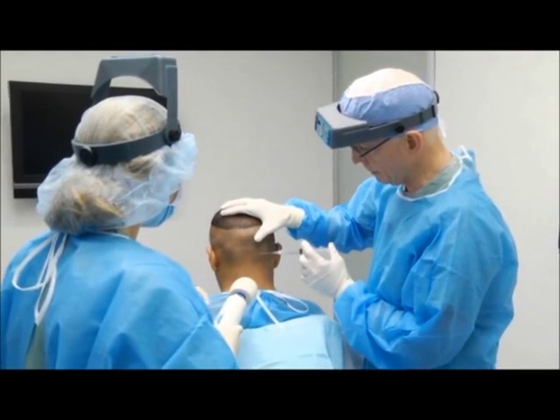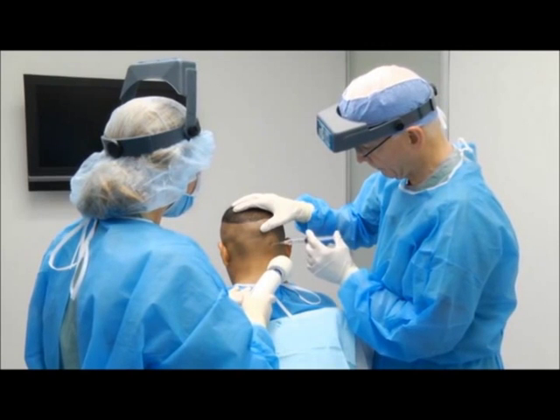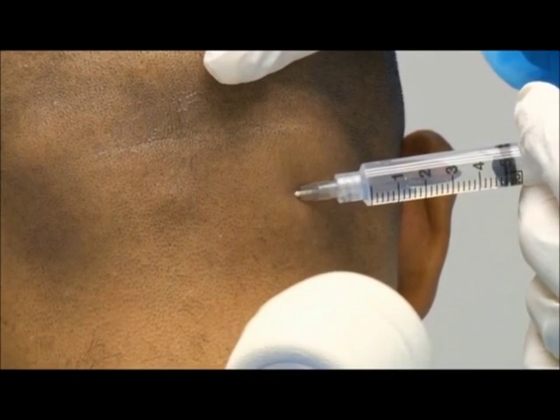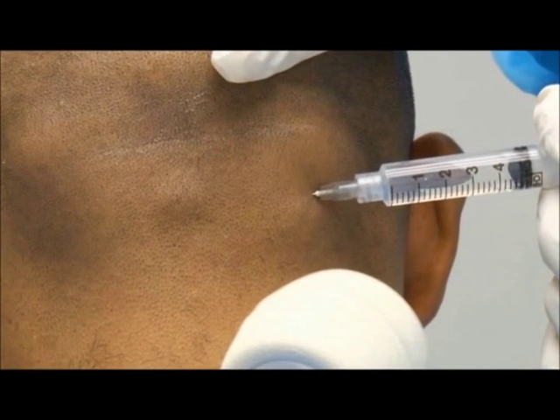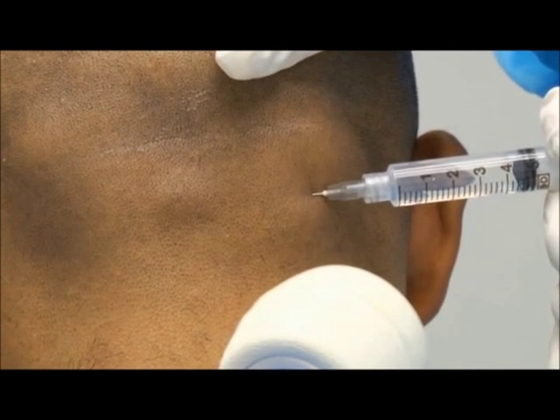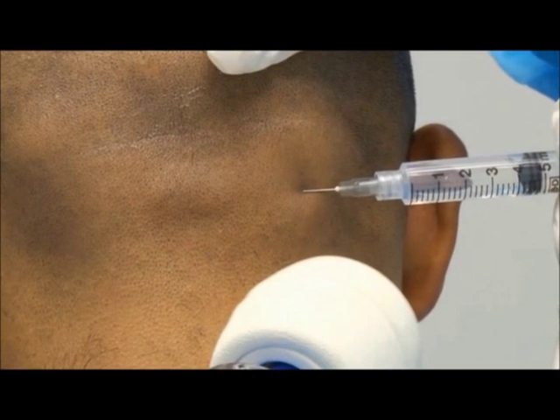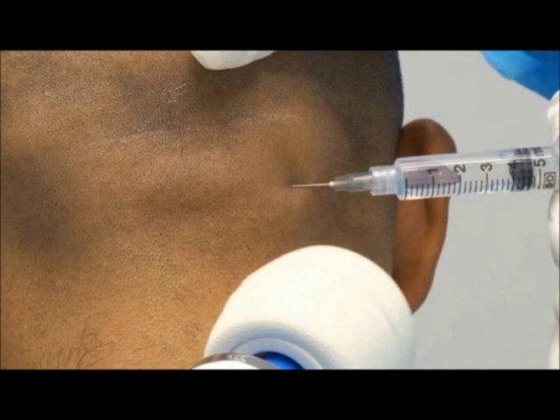We'll start basically at the midline. We advance the needle first, and then just very slowly inject as we withdraw. We'll do this very, very slowly. You can add bicarbonate to decrease the sting of the injection a little bit, but the most important thing is just the rate of injection — you want to inject it as slowly as possible. We're just going to go around the entire scalp.